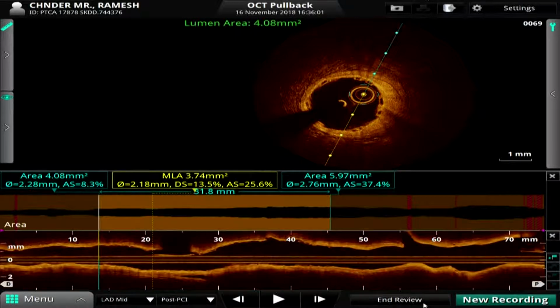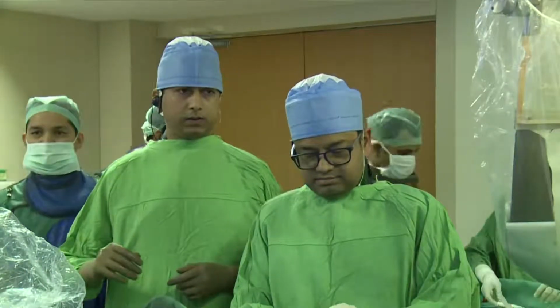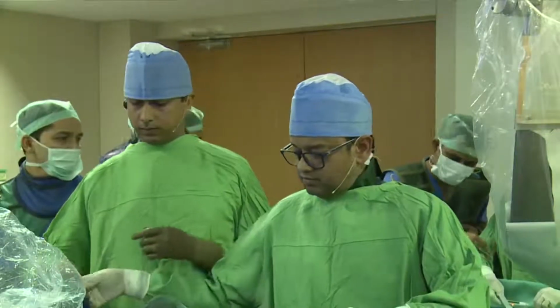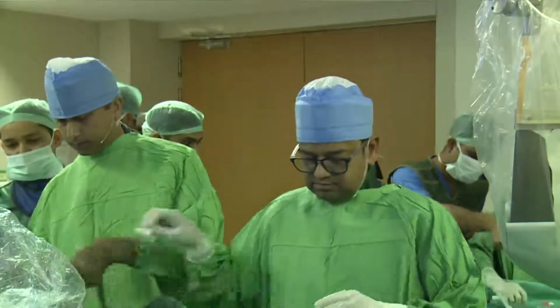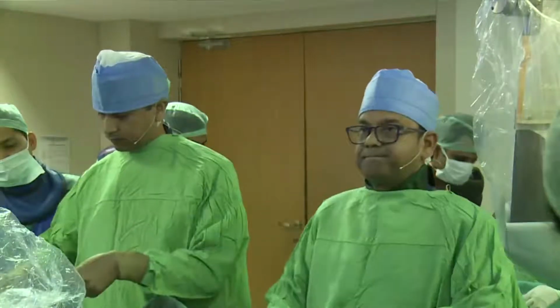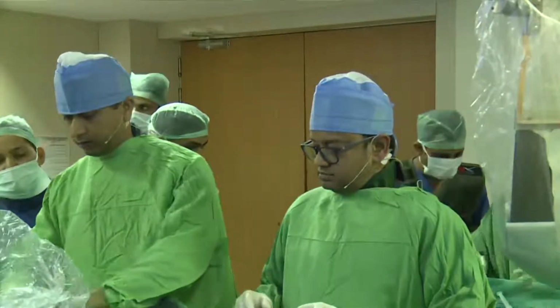Paul already elaborated on that. In seemingly non-heavily diseased LADs, you see a lot of reasonably low FFRs. So there's a gradual decrease, and at the end of the LAD, which this one is huge, it wraps around, it will be 0.82 in a healthy LAD. I think there's always some pressure loss in the LAD. Can we have the wire? Yes, sir.